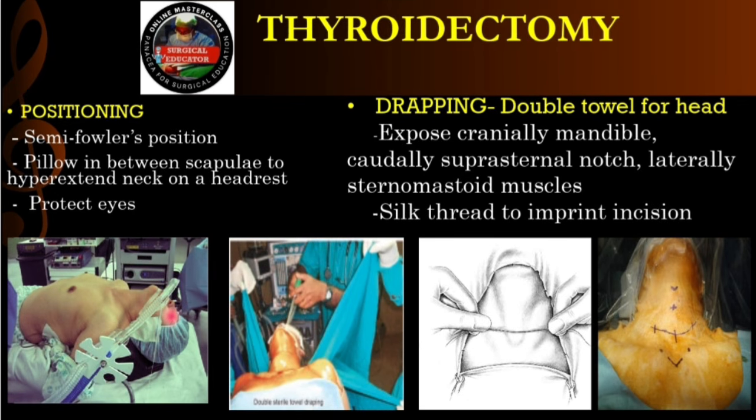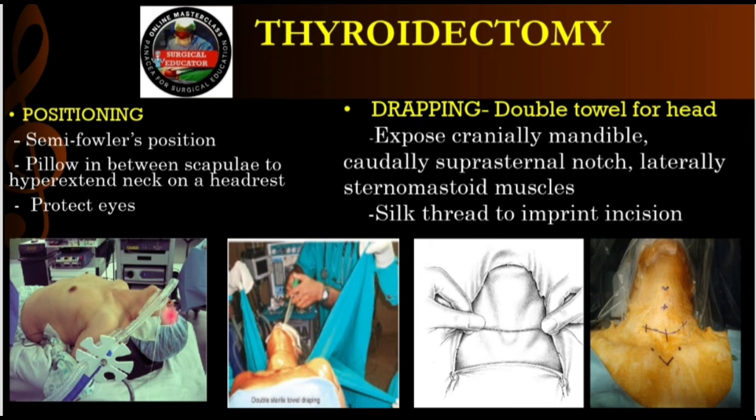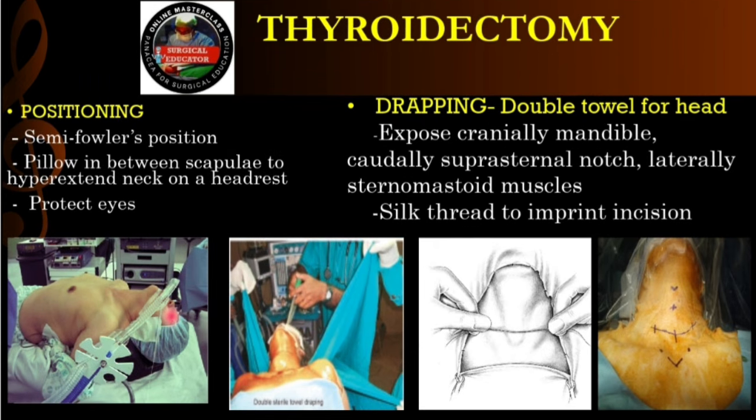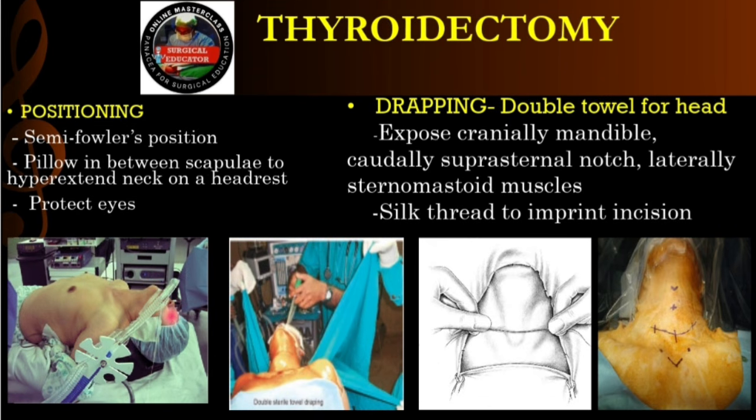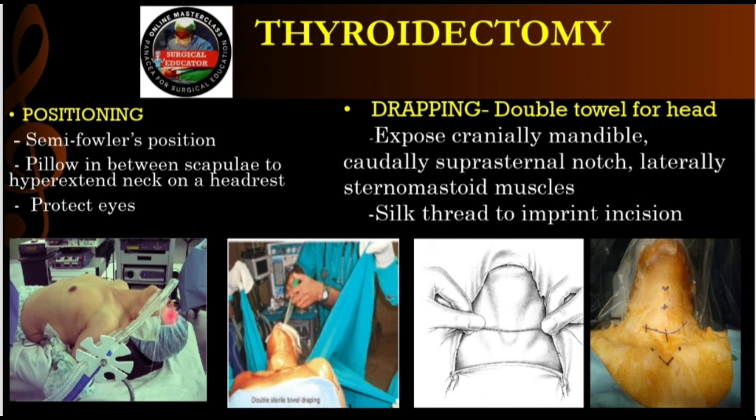And think about what we're doing. We're pouring harsh, alcohol-based chlorhexidine prep all over their face and neck. And swinging metal retractors around their head. Right. If a single drop of that prep runs into their open eye or a drape brushes the cornea, they wake up with a massive corneal abrasion. They'll be screaming in pain from their eye, totally ignoring their neck surgery. So taping the eyelid shut immediately after intubation is just a non-negotiable step. There's holistic care. I love it.